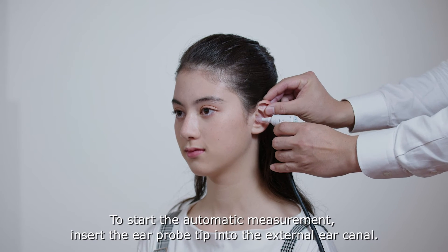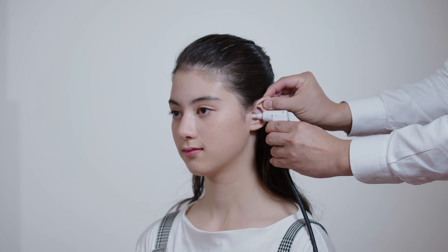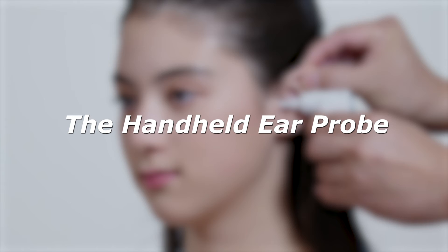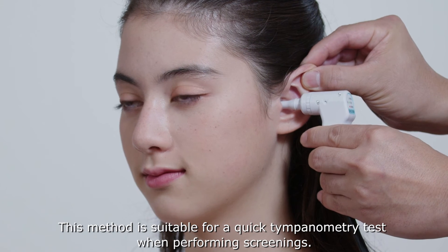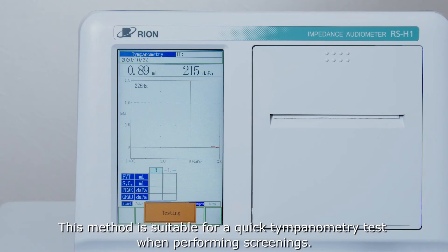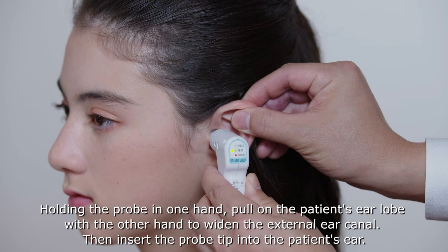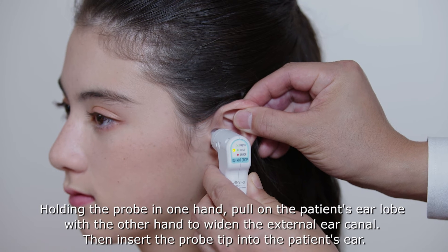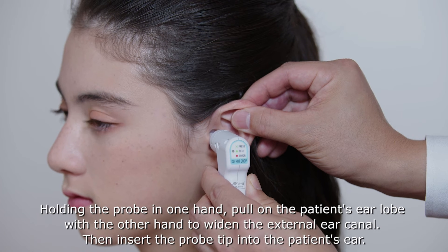To start the automatic measurement, insert the ear probe tip into the external ear canal. The handheld ear probe method is suitable for a quick tympanometry test when performing screenings. The examiner should hold the probe as steady as possible, making sure it does not move. Holding the probe in one hand, pull on the patient's ear lobe with the other hand to widen the external ear canal, then insert the probe tip into the patient's ear.